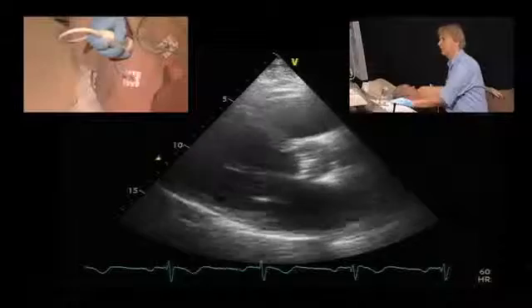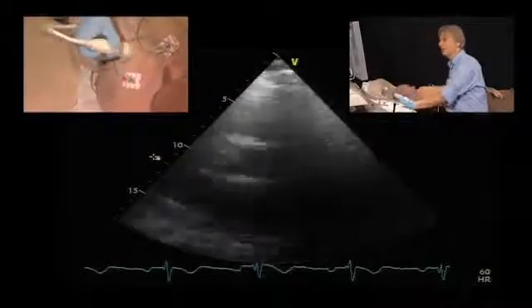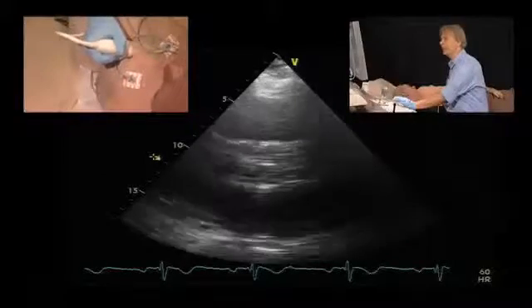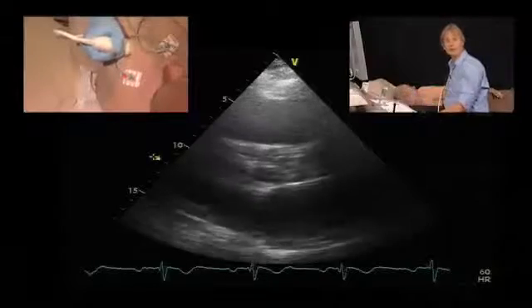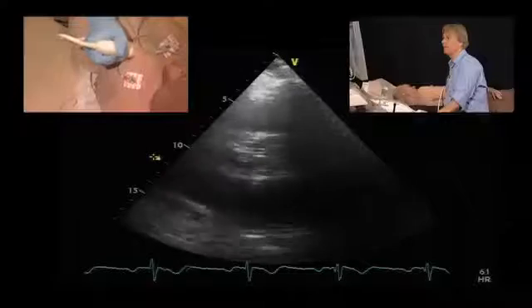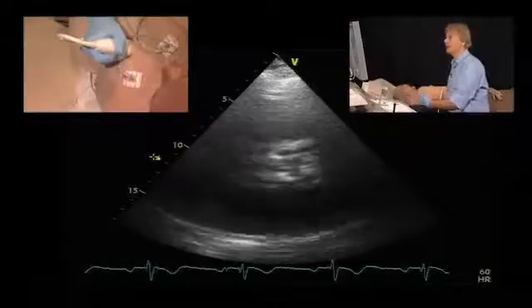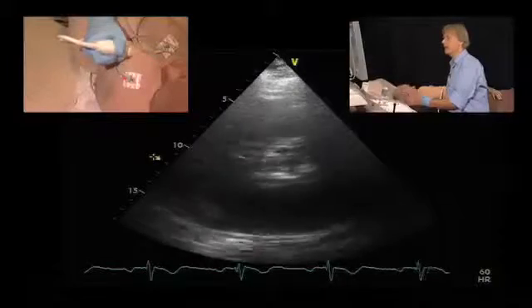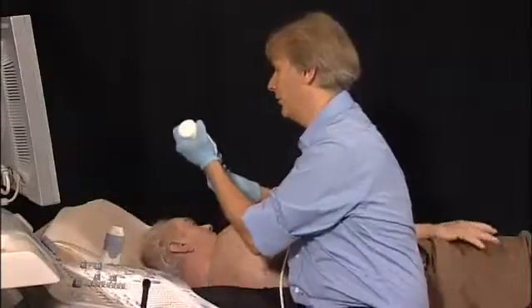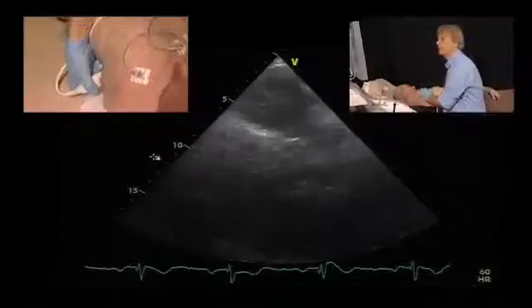There is a reduction in the opening, there is calcification, but I want you to take an exact look at the morphology and how severely the aortic valve is affected, because it will all center around the question, is aortic valve stenosis his problem or not? Well, we have at least moderate to severely thickened calcification, and we have a significant reduction in the opening, so there must be some degree of aortic stenosis, and we can confirm that with the continuous wave Doppler.